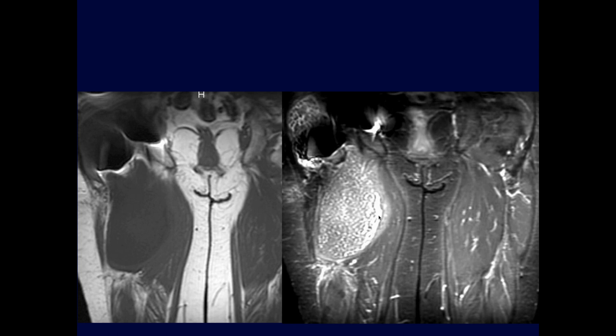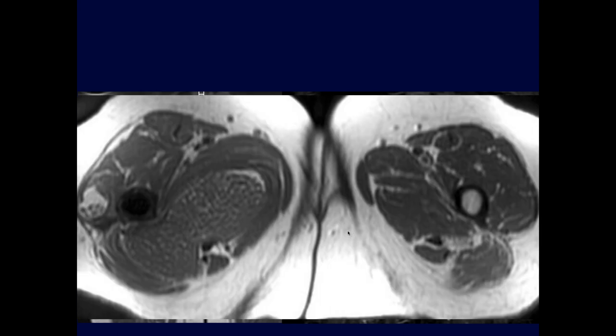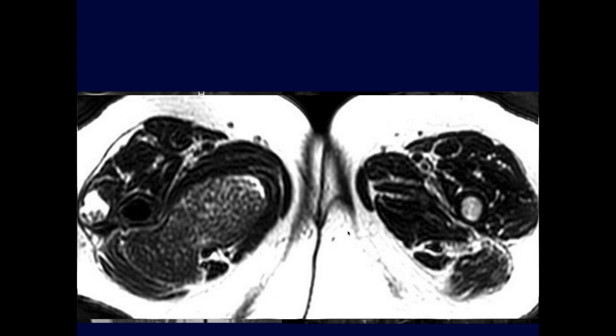All right, this does not look like ankylosing spondylitis. T1 is kind of homogeneous. On the T2 sequences, I think there are multiple, I don't know, synovial nodules maybe. I don't know if this is extending from the hip joint. The patient shows a hip replacement on the right side. These are more focal. I'd be worried about synovial chondromatosis.